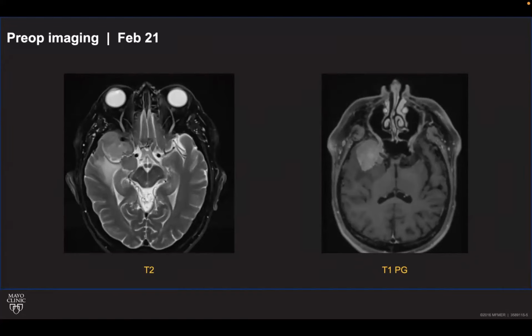Our job in radiology is to keep everyone out of trouble, right? Keep the surgeons out of trouble, keep the radiation oncologists out of trouble, keep the patients safe. And that's exactly what you did too, right? And the way that I do this is, take a look at the entire tumor and say, anteriorly it abuts this area. Medially, it's right at the level of the anterior clinoid. Posteriorly, it extends here. Laterally, it does this. And then you can say within the central part, this encases the MCA, and then give a description. Say, is it narrowed? Is it not? Right? Because if I say it's narrowed, you guys know that it means this tumor is going to be closely abutted. Be careful. This thing might be adhesed to the vessel rather than just peeling it off very, very quickly.